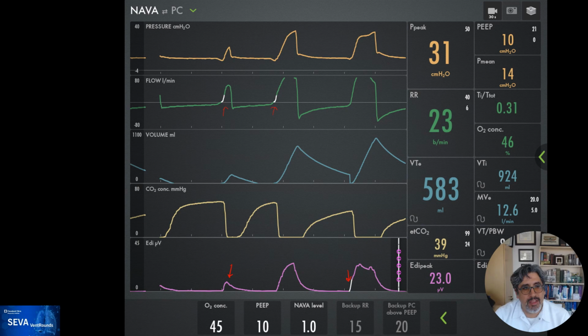And the good thing about this is that then you can compare what happens to the pressure. You can see that the pressure in the airway before the breath drops in the first two breaths. Even though afterwards it follows the activation of the diaphragm, you can see that there are some inefficiencies from the flow triggering that we know happens in this patient because of severe obstructive disease. But if you see the last breath, that inefficiency goes away. You barely see any drop in pressure during inspiration, and the flow just matches what's happening during inspiration over here.